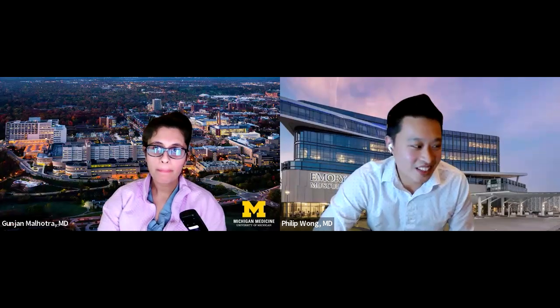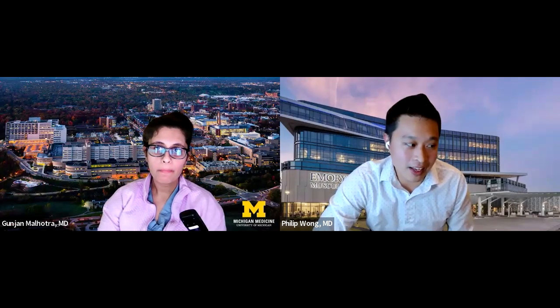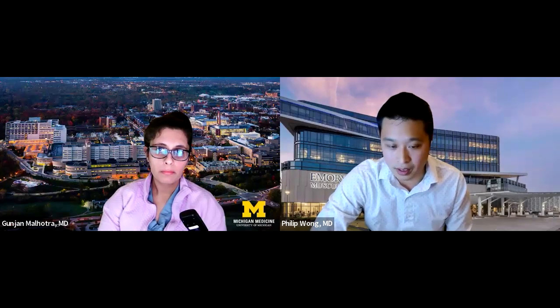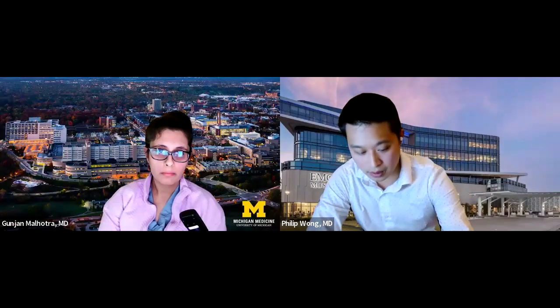Do you do whole body neurography, and is there a good resource for learning the nerve anatomy? E-anatomy can be overwhelming, is what one question is. We don't do whole body neurography. We really focus on whatever site is injured for patients, or even if patients have neurofibromatosis, we haven't really done full body protocols yet.